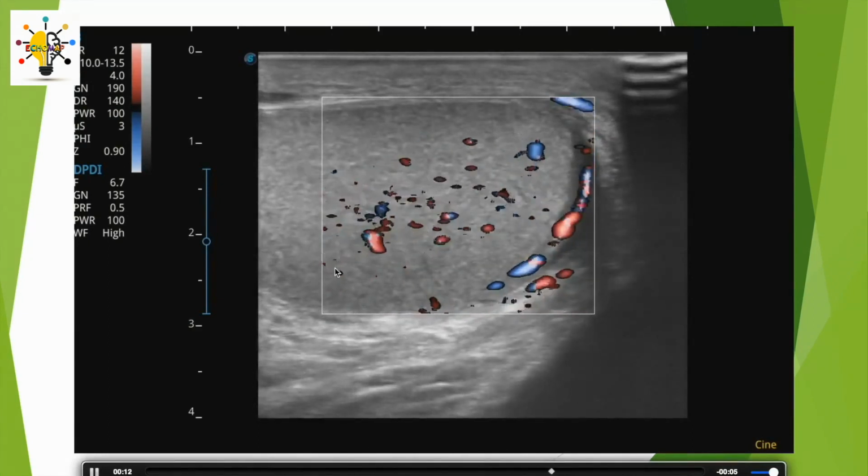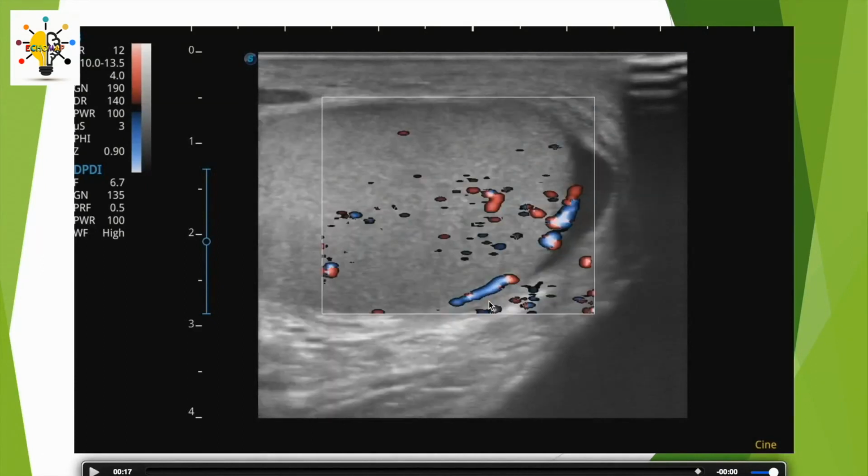So in my opinion, effectively, a testicle that is large. So is it orchitis? Is it simply a case of right-left asymmetry in our patient, who may have had one testicle a little larger than the other? In all cases, the diagnosis of epididymitis was certain. It was subsequently confirmed by biology and ultrasound in this patient, who was quickly and successfully treated. So a nice video. Epididymitis anyway, perhaps with an associated onset of orchitis.